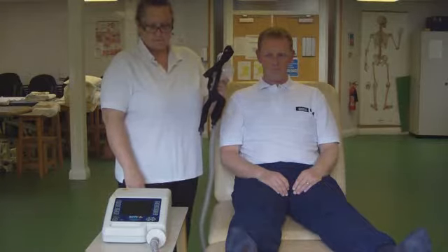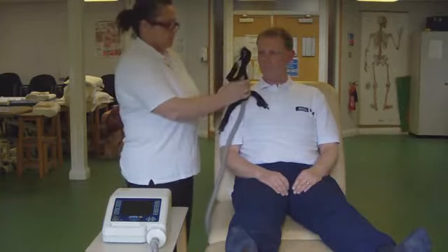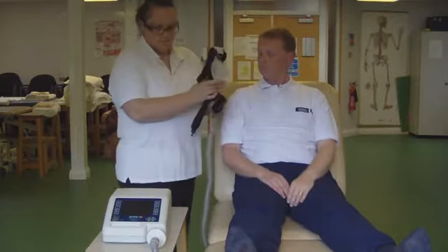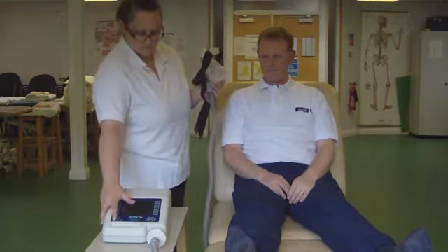Now, before you apply any form of this, you need to switch the machine on and you need to demonstrate to the patient what the flow of air feels like. You then turn the machine off, fix the mask to the patient, and then move forward.